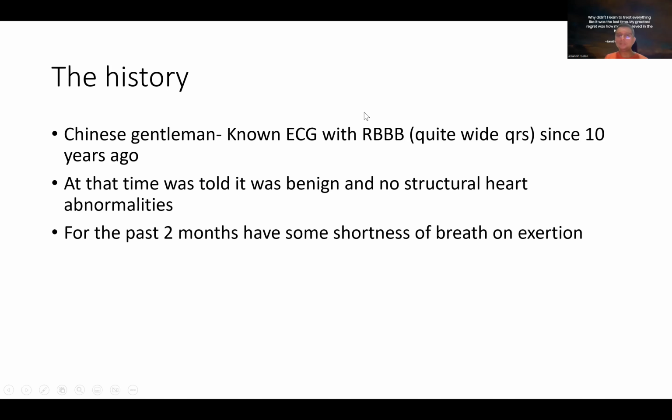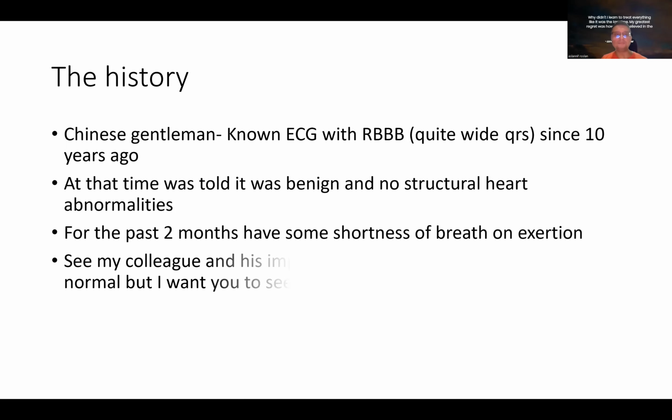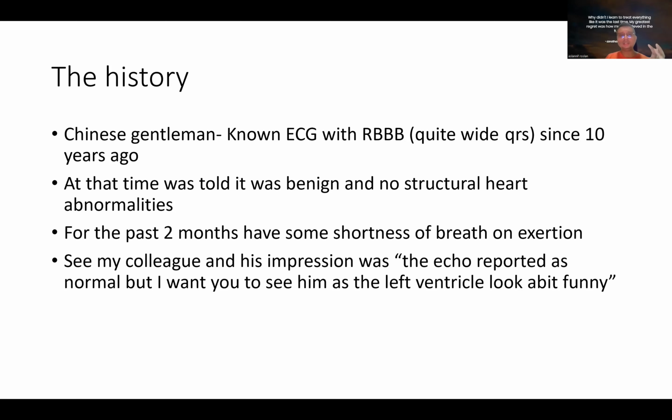For the past 2 months, he has had some shortness of breath on exertion. This case was referred to me by Dr. Mazni, one of our pediatric cardiologists, because he was taking care of the patient when the patient was a child. So he saw this patient before, and his impression was the echo was reported as normal, but I wanted you to see him, as I think the left ventricle looked a little bit funny.